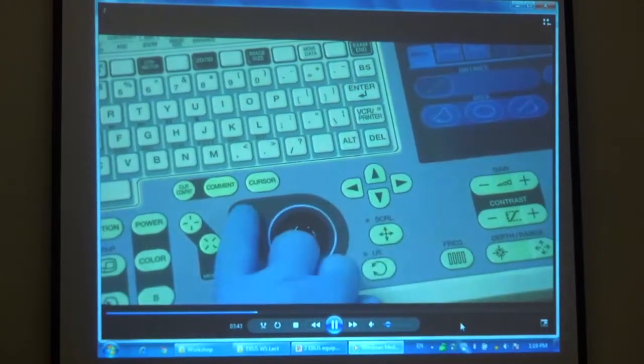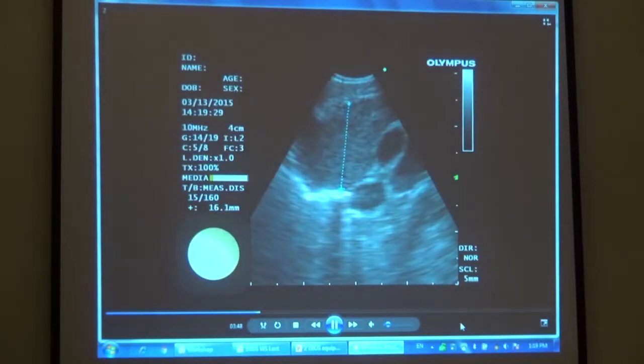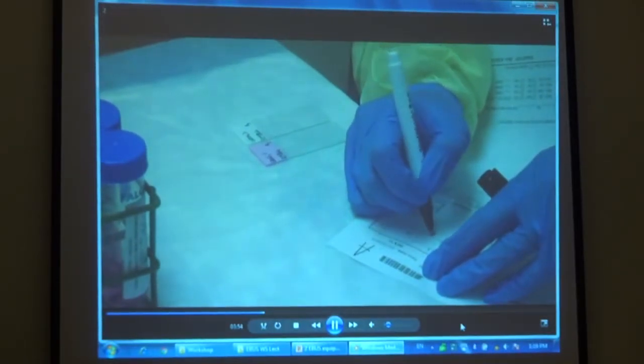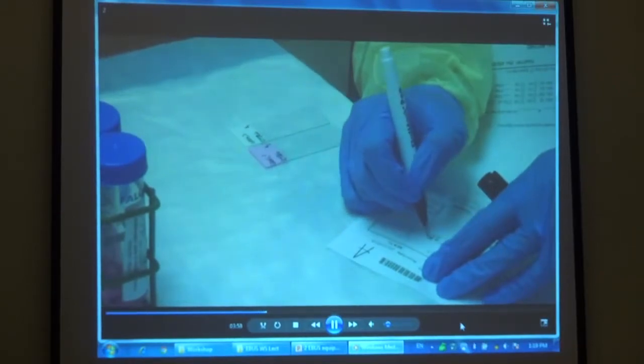For lung cancer staging, nodes 5 millimeters in size or greater are biopsied. The ultrasound survey helps define the order in which nodal stations will be biopsied, allows assistants to prepare available slides, and ensures a logical sequence of nodal sampling from contralateral to ipsilateral mediastinal and finally to ipsilateral hilum.